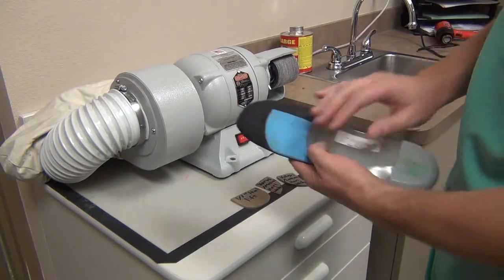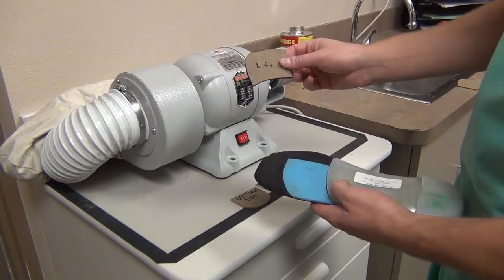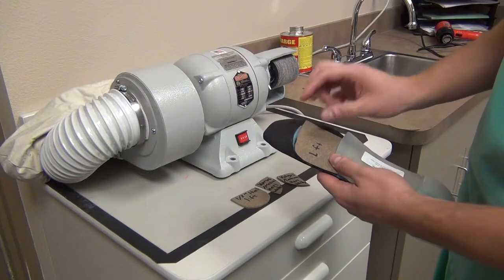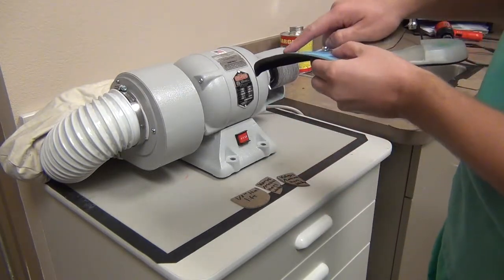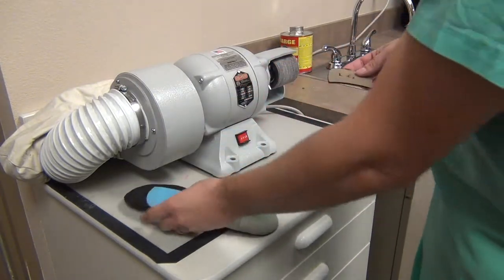You can see this orthotic already has a reverse Morton's extension on there, but you can use this template and cut out an actual replica of it. What you're going to do is glue this onto the orthotic, and before you glue it on, it's very important that at the very end of that pad, you taper it. If you look very closely, you can see there's a nice smooth transition there.